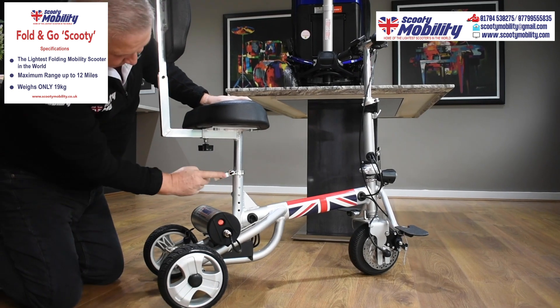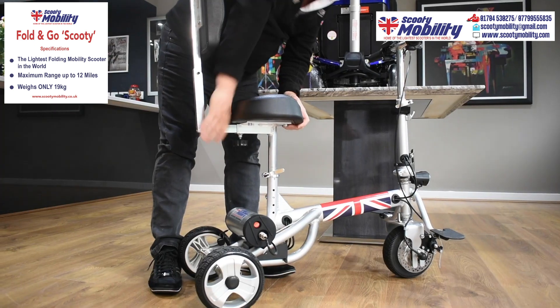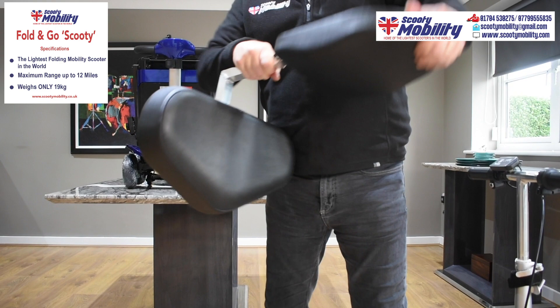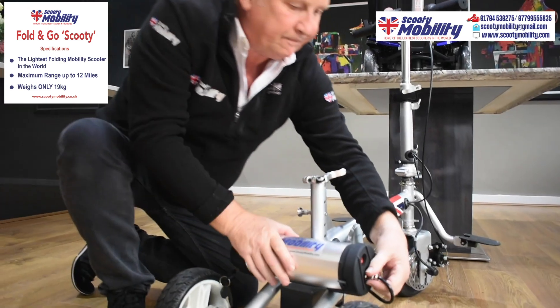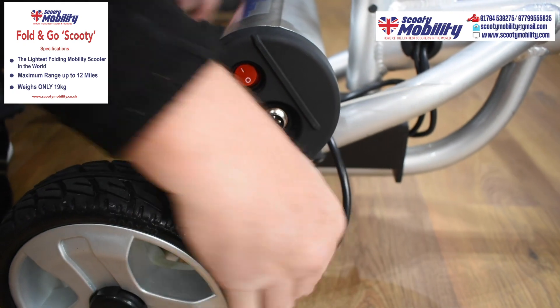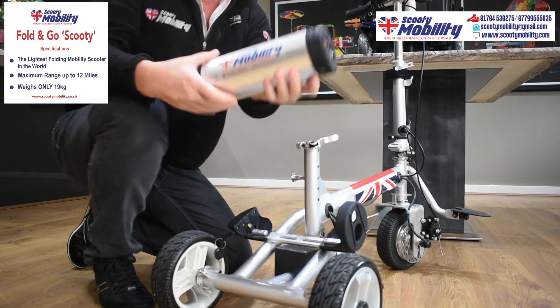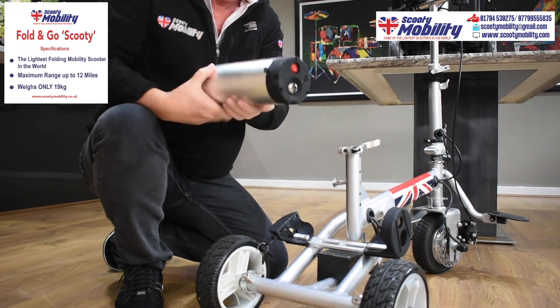Now let me dismantle the scooter. There's a quick release catch on the seat post — just release that and lift the seat out. The seat folds into two halves, folds up nice and neat. This is the battery pack, a lithium battery. You can charge this battery on or off the scooter — if it's more convenient, leave the scooter in the car and take the battery into the house to charge it separately.